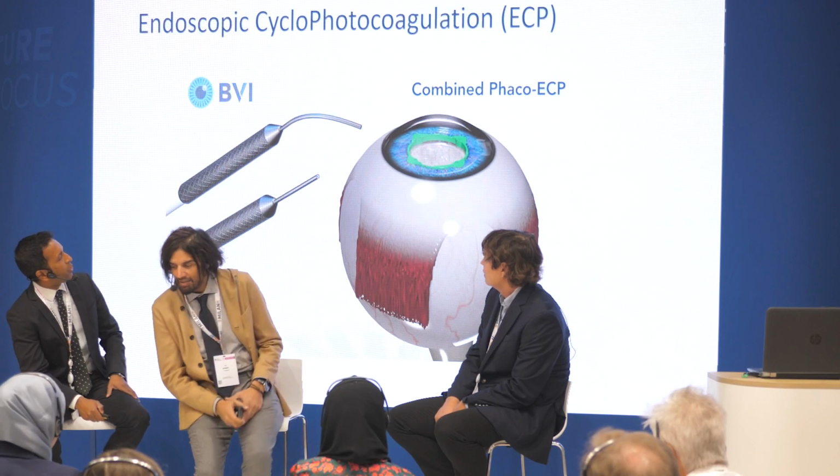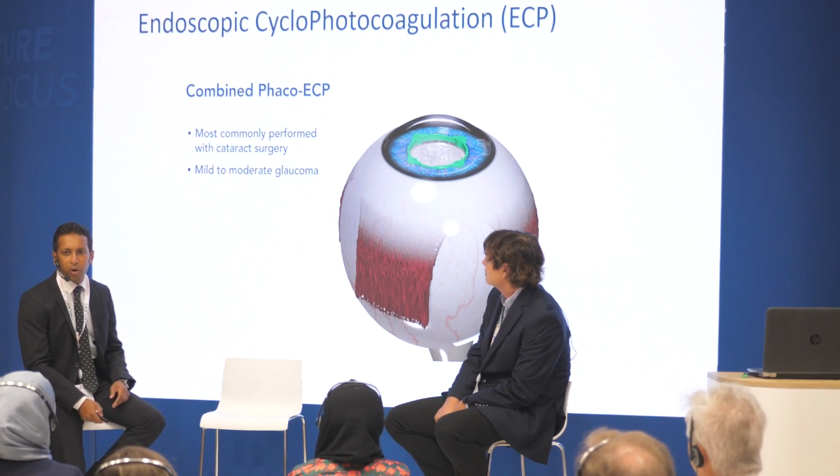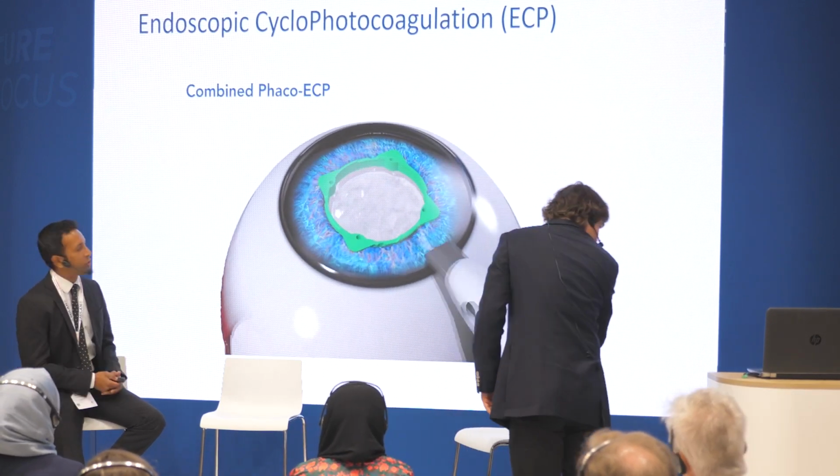Okay, so this is the probe. I'm in the way. I'm going to stand over here for a second. You have 2 probes, either a straight probe or a curved probe. Personally, I prefer the curved probe. It gives a bit more ergonomics, and you can get a bit more treatment area.